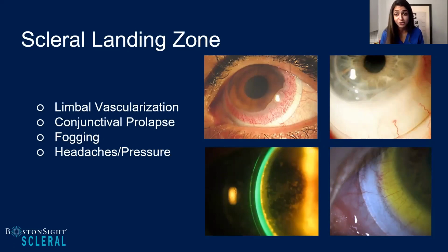And just like every shoe, every brand has a certain fit and a size. You wear your shoes if they're comfortable, and it's our job to make sure that the scleral lenses are comfortable for the patient. But if the patient wiggles their toes, they know their shoes are on. Same thing with the contact lens. If the patient blinks, moves their eyes, they know that the lens is on the eye. But the goal is we need a comfortable pair of shoes, and we need a comfortable pair of sclerals. Absolutely.